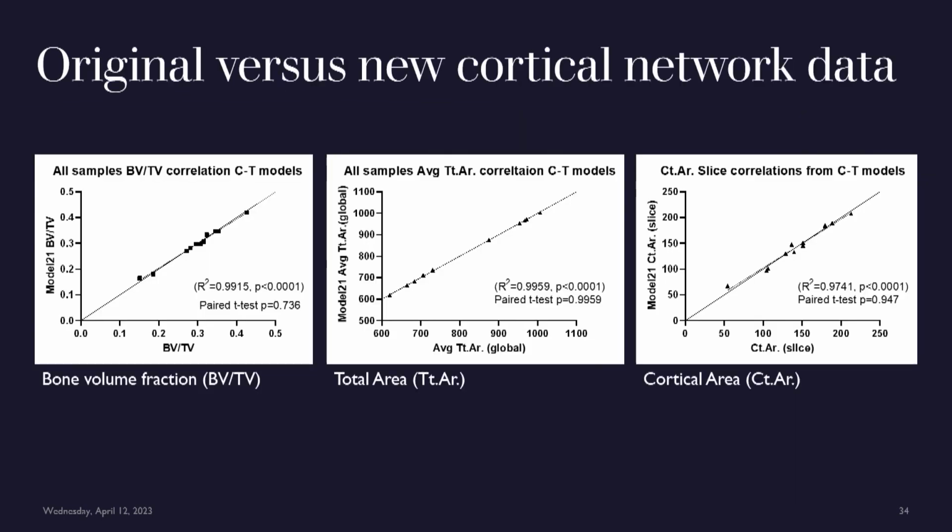And so one thing we wanted to check was, when you had the original outputs versus the updated networks, did that change the data? Because we were trying to make things faster, we were like, well, the new networks do better. What if instead of being as painstaking with the quality checks, we go through and say, if something is a voxel that's highlighted that's truly wrong, we'll erase it. Otherwise, we're not touching it. So if there's some little gaps, we didn't want to deal with it. And it turns out that it really had no impact on our data.